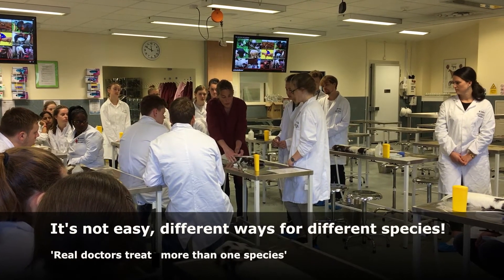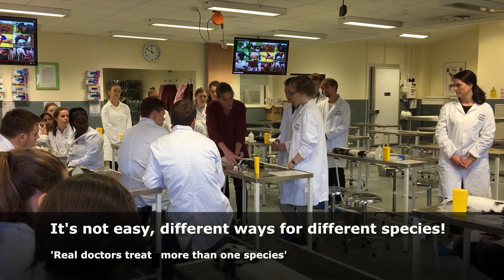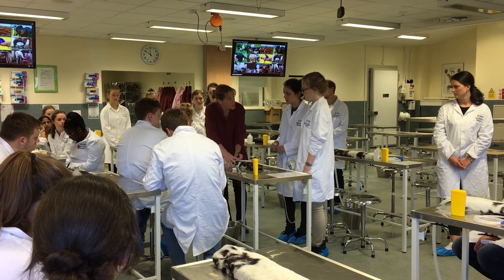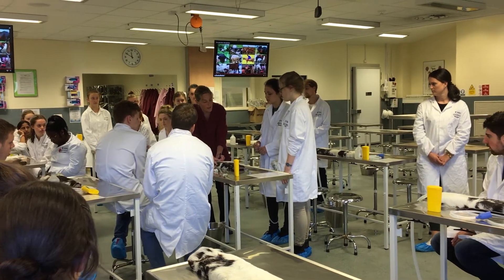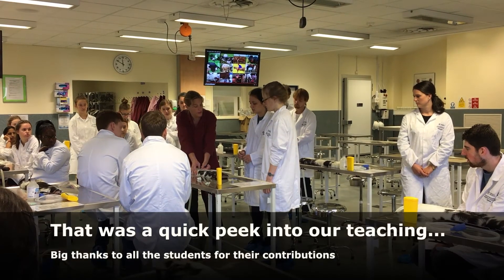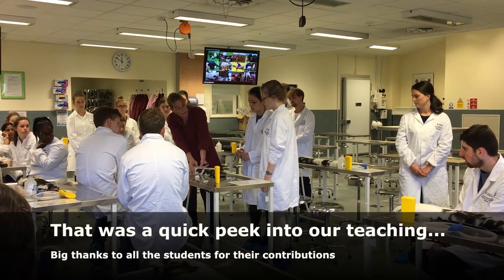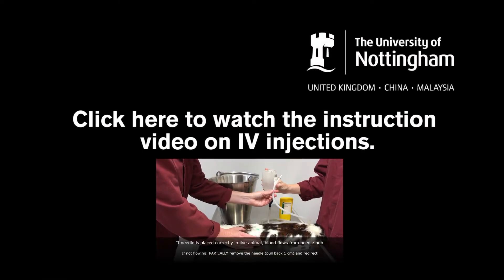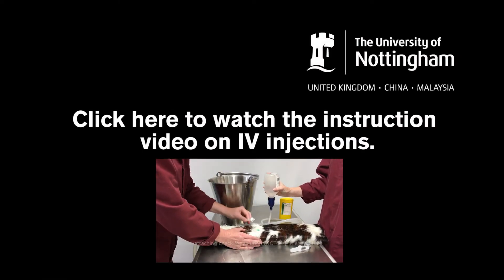With our cow, if she's going to thresh her head around, I don't want your finger there, because if you start to move your needle, you might actually move it towards your finger. So that finger has no reason to be there. I want your finger out of the way. Occlusion here, yes, definitely. And that's not a risk, because you're pushing away from your thumb. I want your finger to see how it's moving.